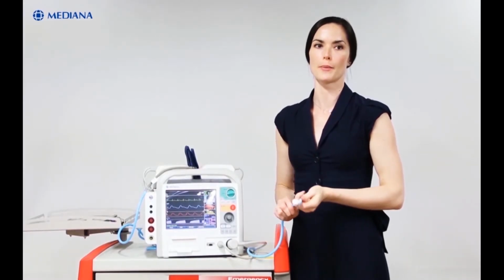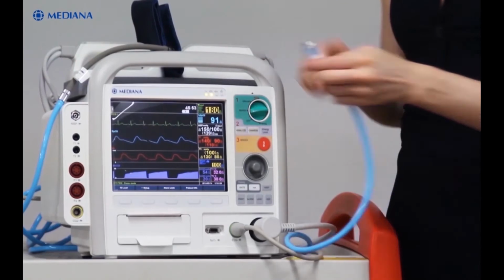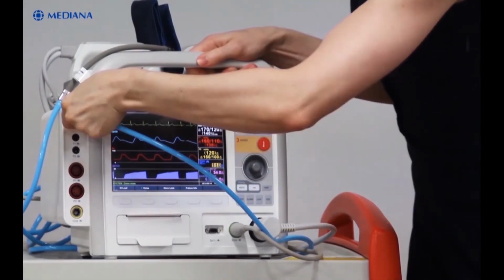First, we have to select an appropriate size cuff for the patient, and then connect the hose to the NIBP connector, making sure to tighten the connector in the clockwise direction.